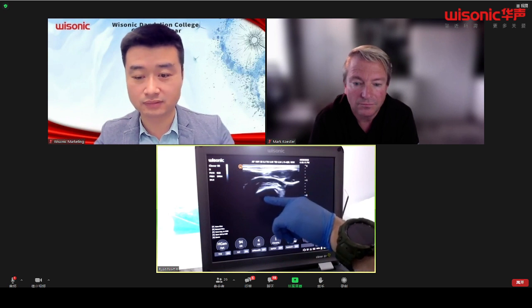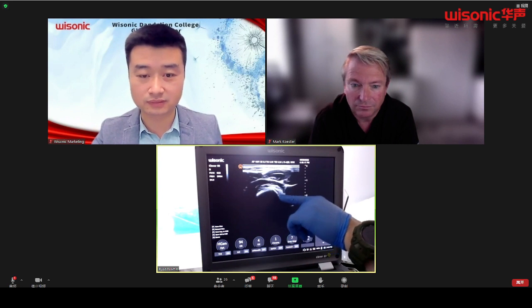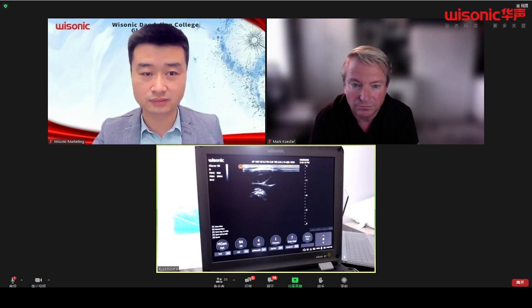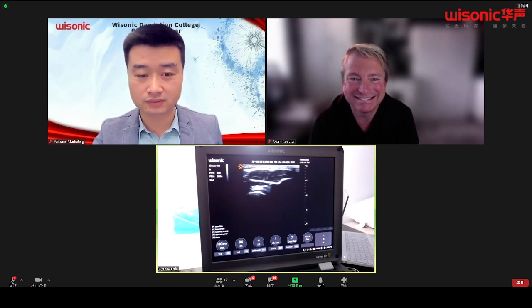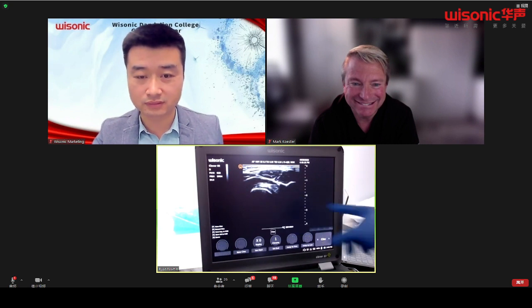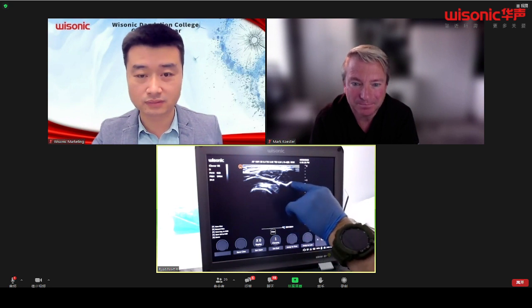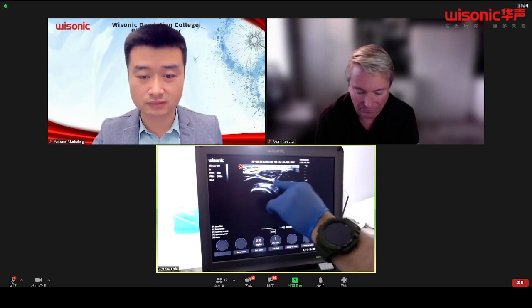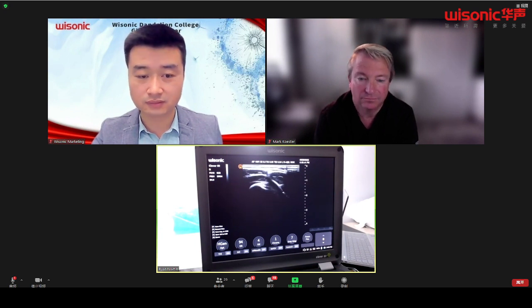And what we're looking for, and try and pronate that as far as you can towards me. Well, and I would have probably a little talk with our subject here about the integrity of his tendon, but since we're just doing a simple scan here, there it is right there. So you can see, I'm going to hit freeze. You can see that peak right through here. Here's the ulna and the radius, and there's that little parrot's beak of that distal bicep right there. Once again, do that for me as far as you can.